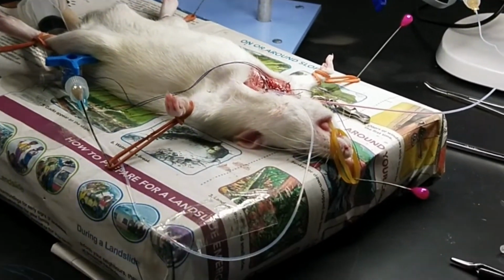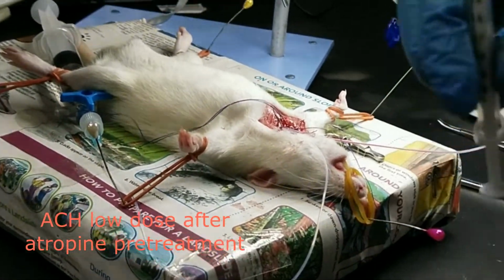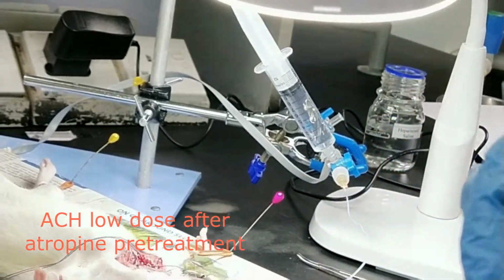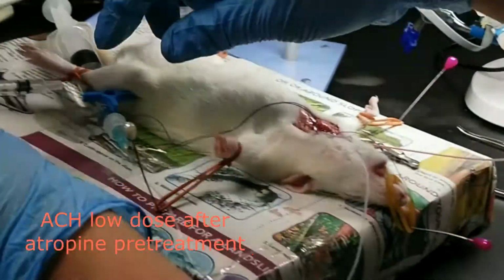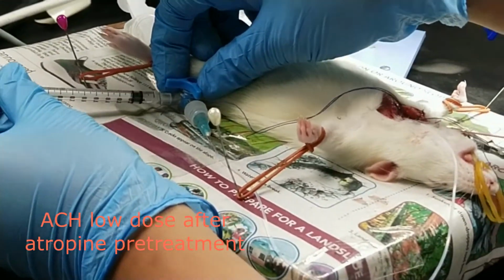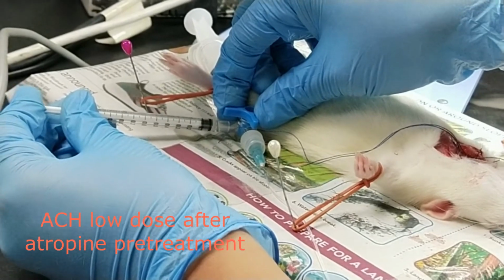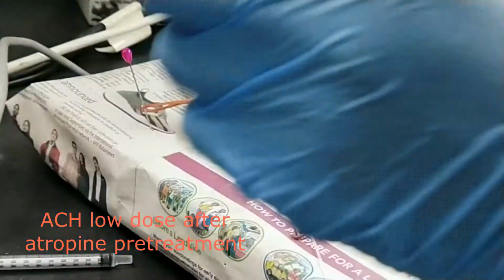While the effect of atropine is still in the system, next we're going to proceed with the pre-treatment of ACH, the low dose ACH, which is 0.5 microgram per kg, through the system. Then proceed with 0.5 ml of normal saline.